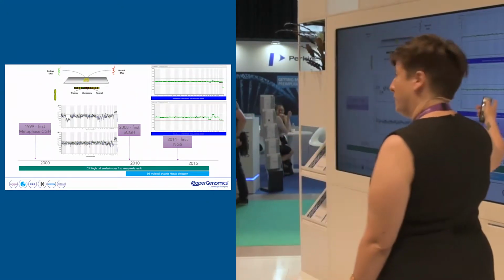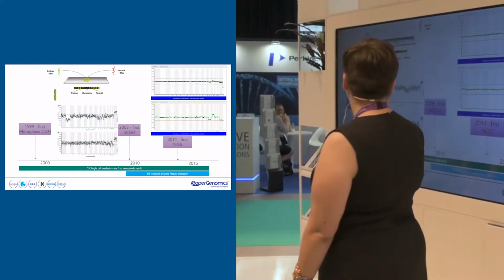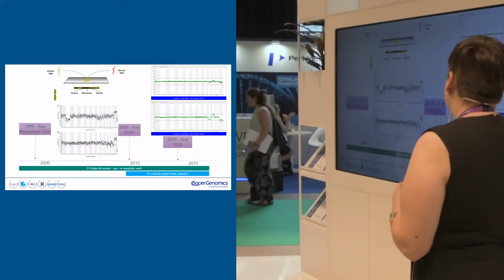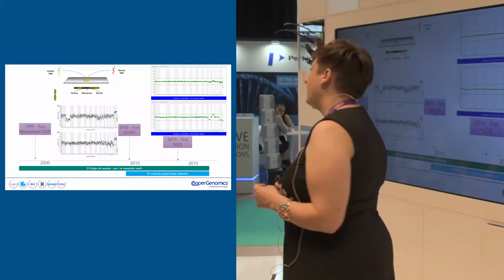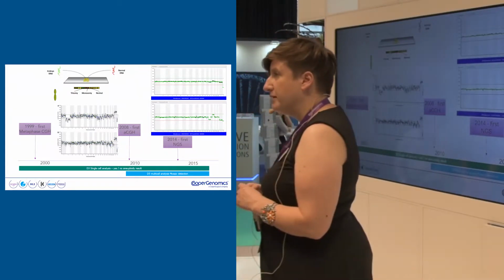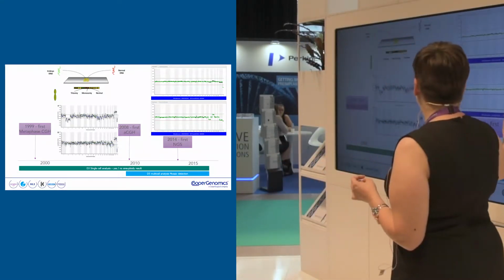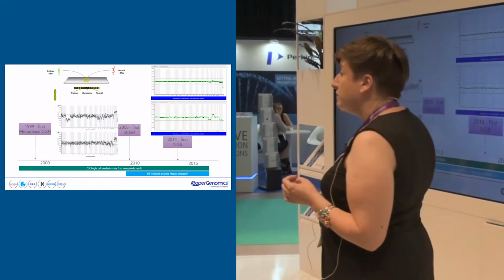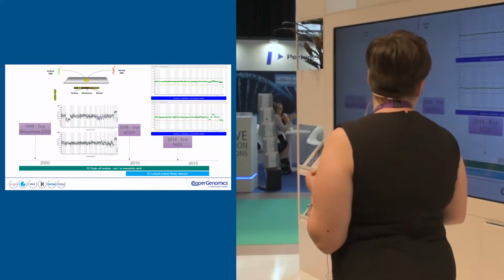So this is what the lab is used to seeing today, next generation sequencing. And arrays do look a lot better than that today as well. Next generation sequencing, we started using around 2014. It was initially used for patients with chromosome rearrangements, particularly ones with small imbalances, because we can get smaller imbalances from next generation sequencing than we could with the arrays, because it is a sequencing-based technology.